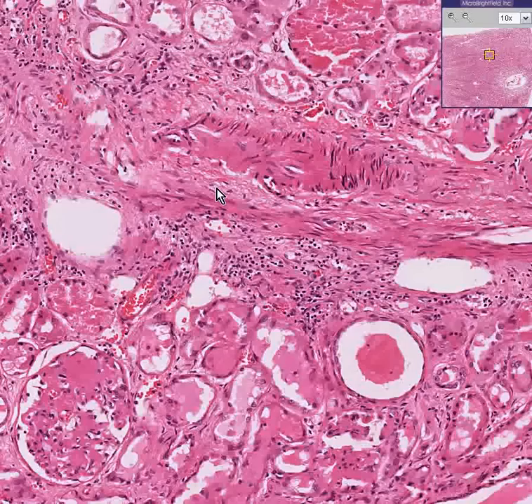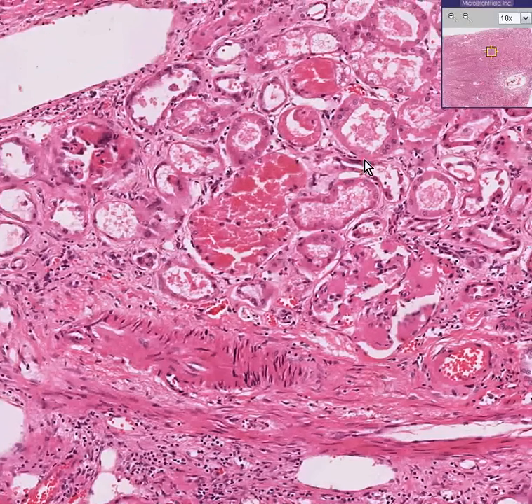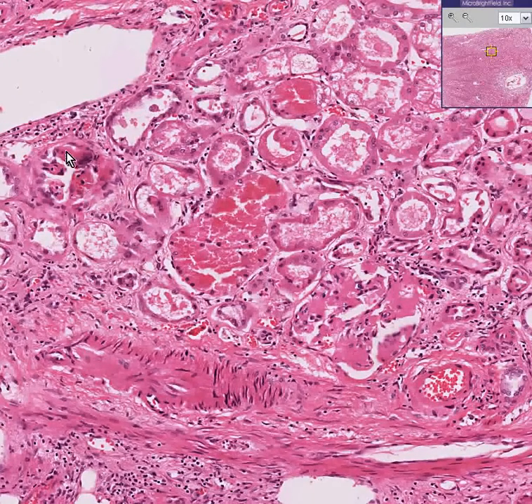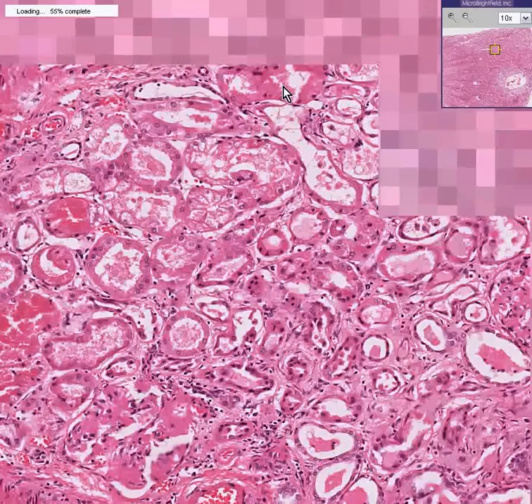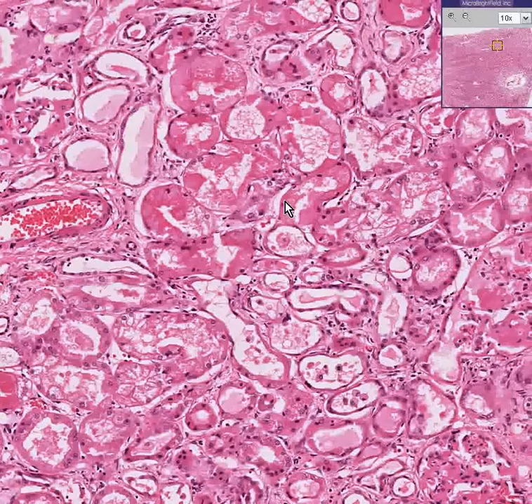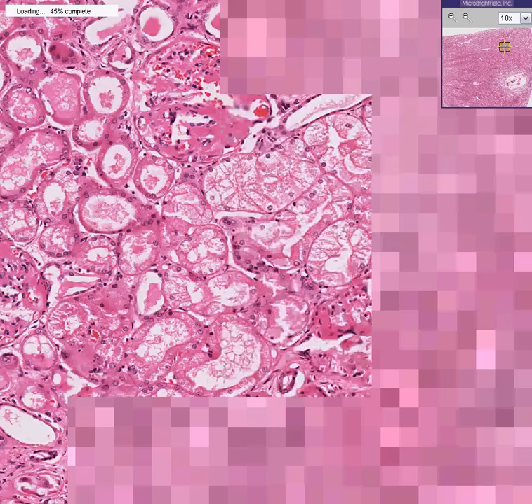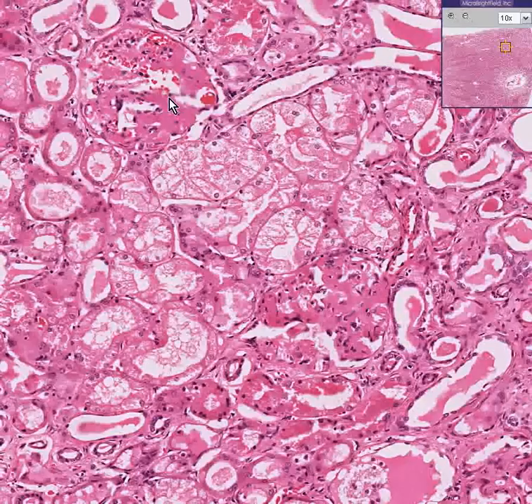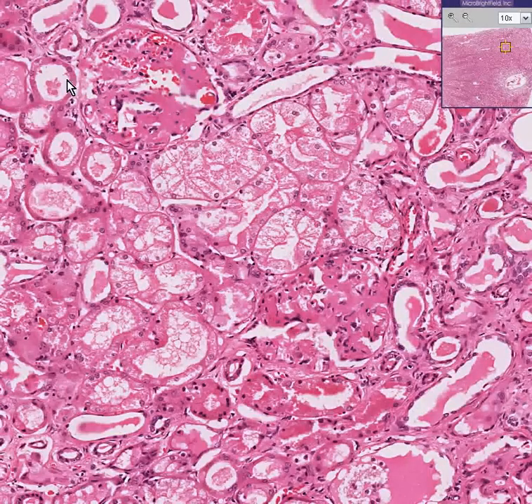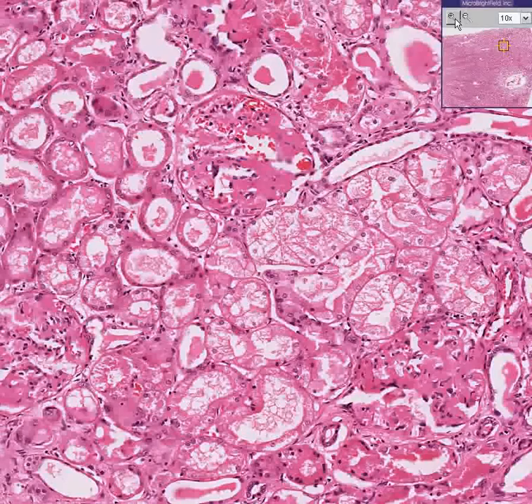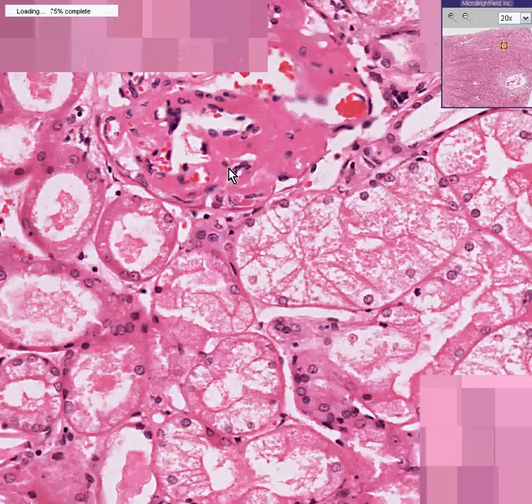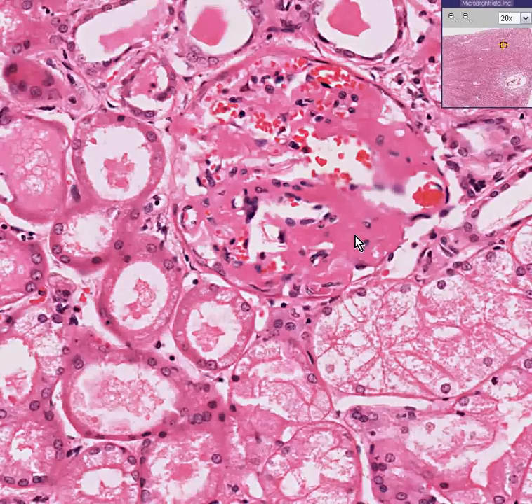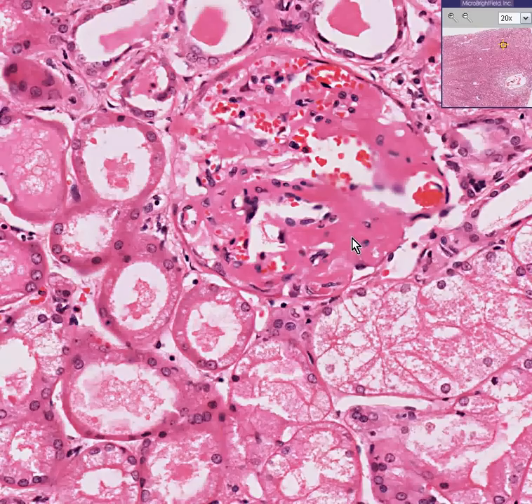Let's find another glomerulus and see if we could see much of the same thing. Here's a remnant of one, and you could see some more of this material again. Here's part of a glomerulus here as well, and here's another one. Notice that although you can recognize this as being a glomerulus, once again you can see that a large portion of it is replaced by this pink or eosinophilic hyalinized, glassy or granular material.